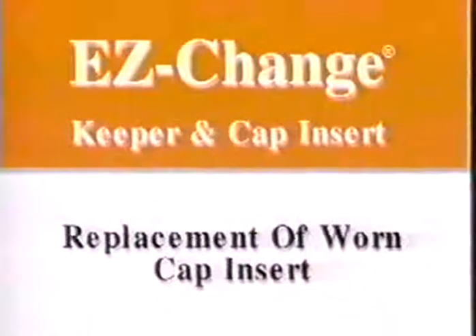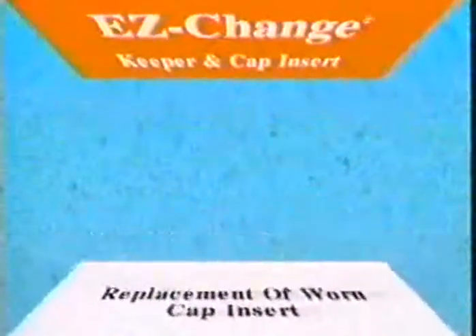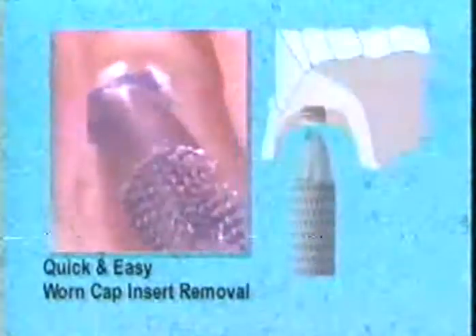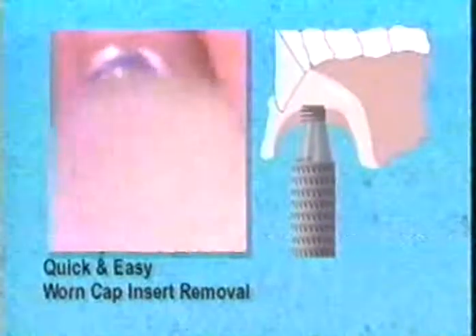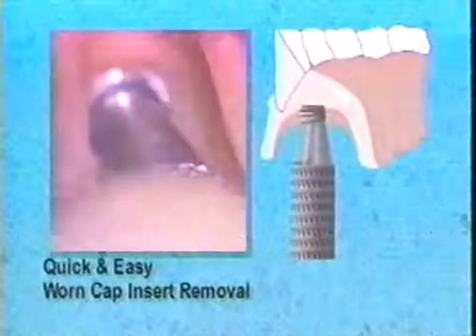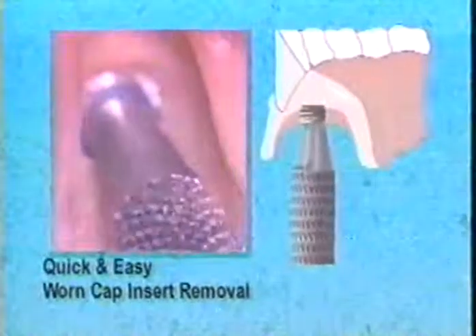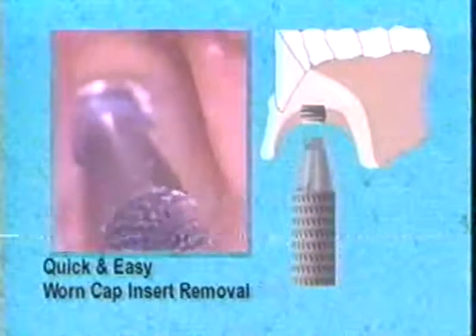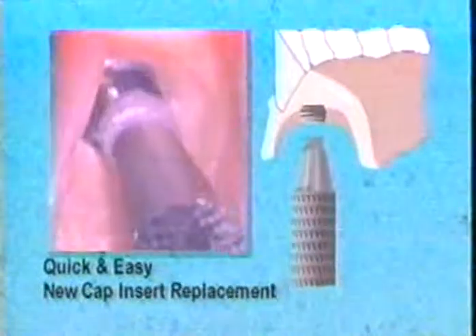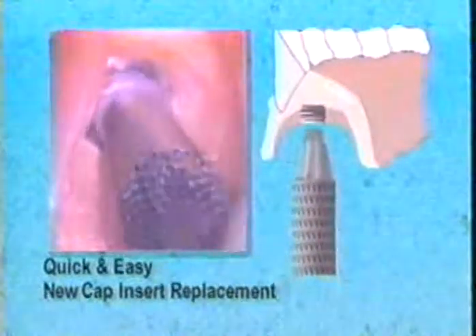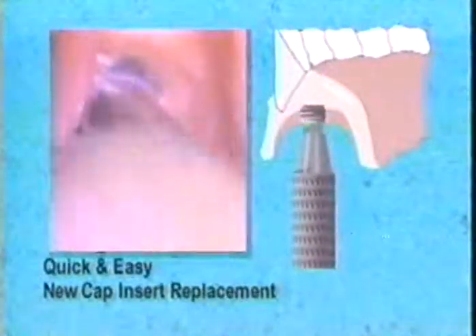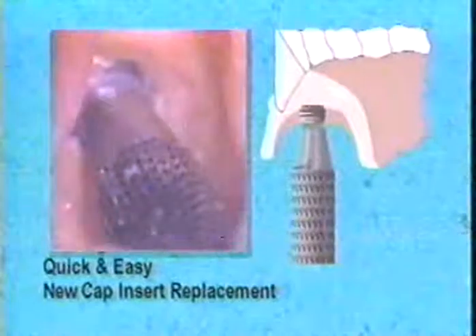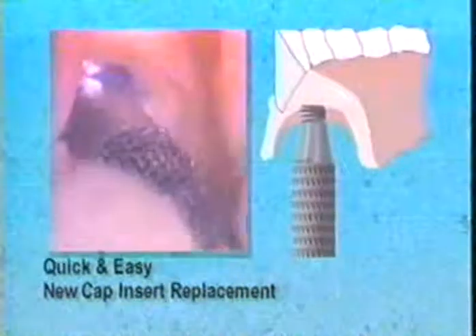Replacement of worn cap insert: The Easy Change cap insert may be replaced by inserting the two-pronged Easy Change Wrench into the worn cap insert and unthreading it. Replace by threading in a new cap insert. This procedure is completed in seconds.